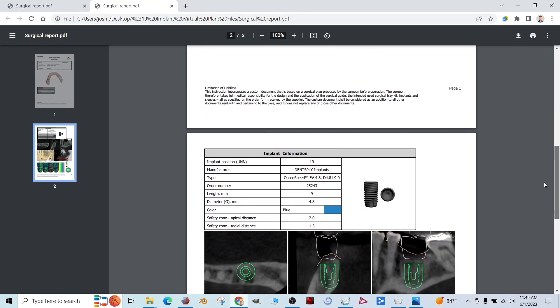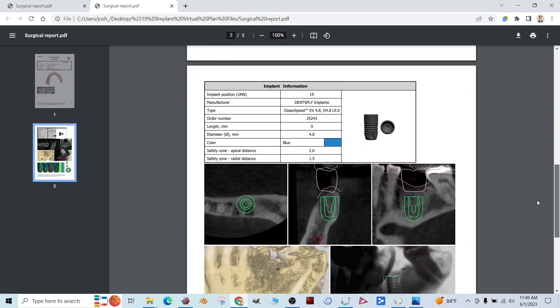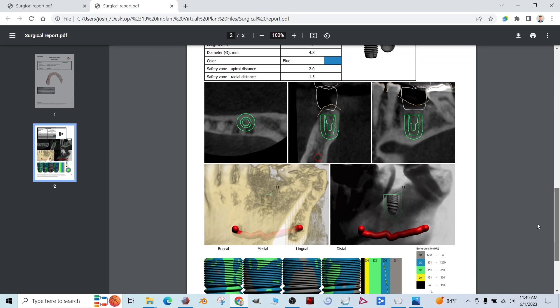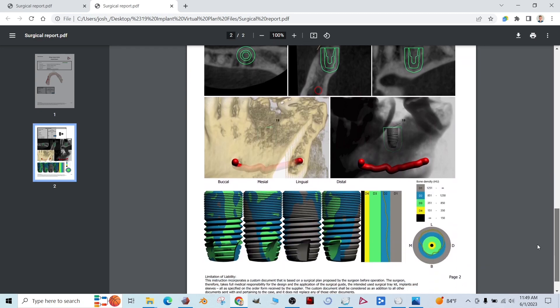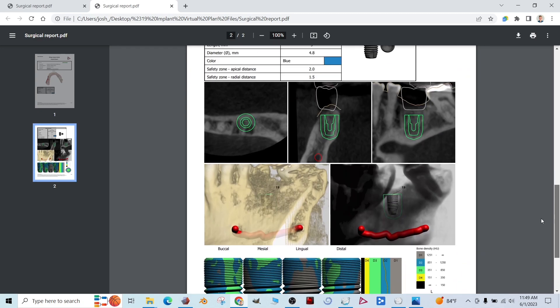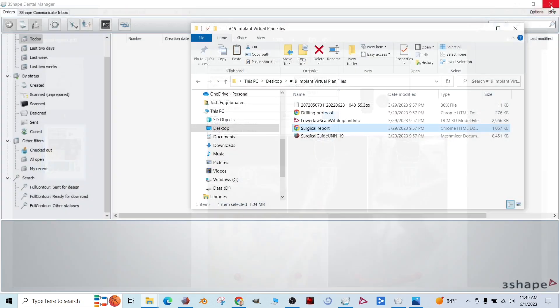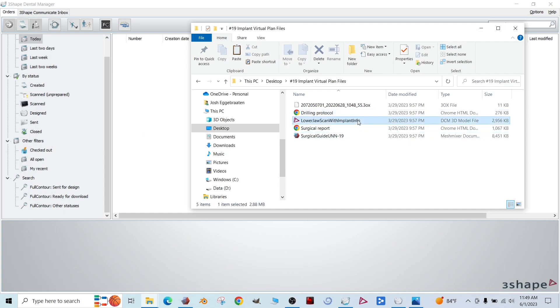So this is a number 19. We're placing an Astra EV 4.8.